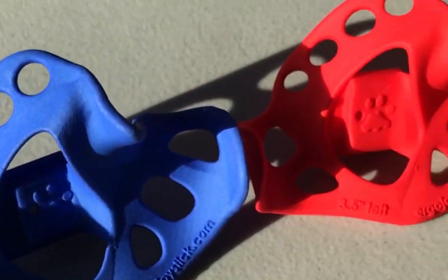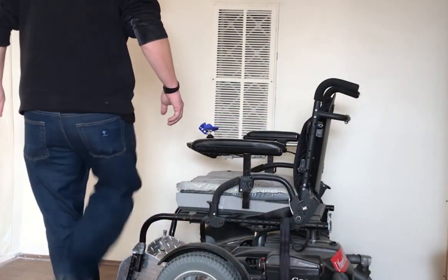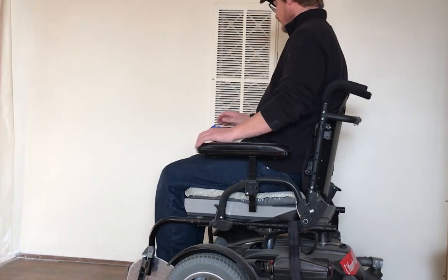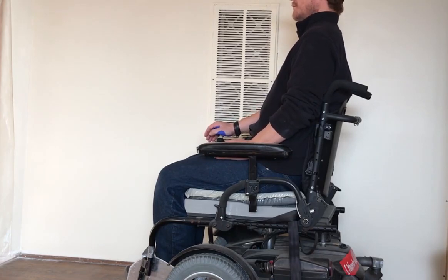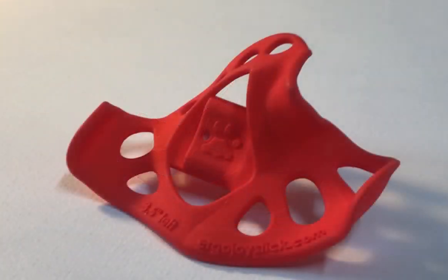As you know, to understand anything about wheelchairs, including joystick handles, you need to try it yourself. Before you sell this handle, we would like you to try it for a day. If you are not currently a power chair user, use one of your demo chairs for a workday for everything besides climbing steps.